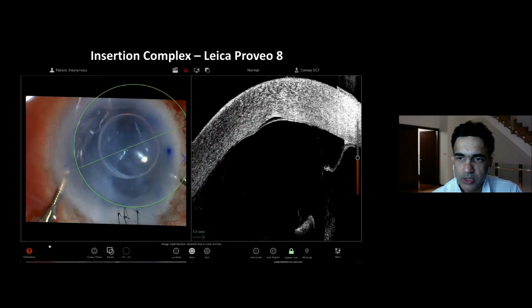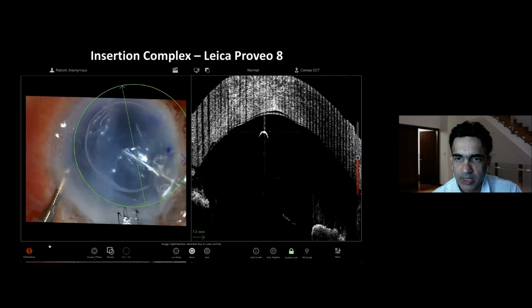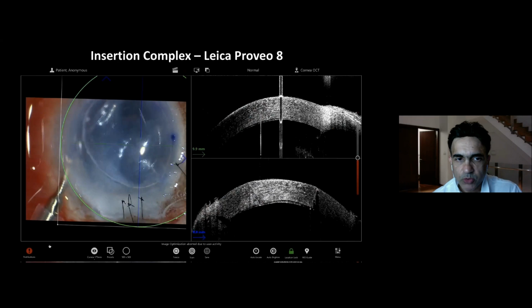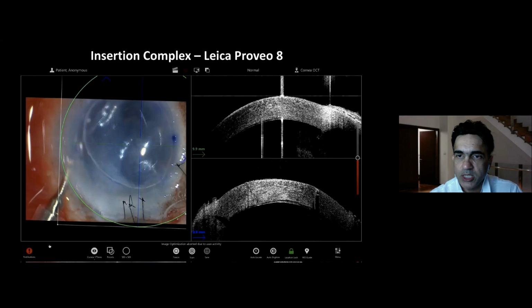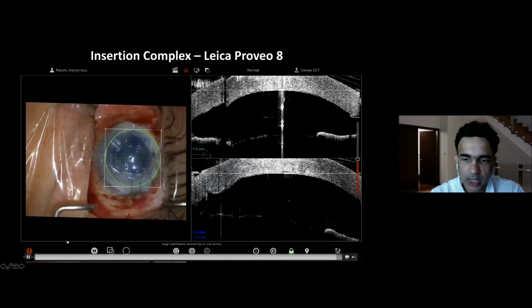Okay, now you can see the graft is nicely open inside the anterior chamber, and I've put a complete air fill or gas fill inside the eye and finished suturing the case itself. So a difficult case with a lot of PAS, but you're getting that extra information back from the OCT to help you with the surgery, to guide you on how to open up the graft.